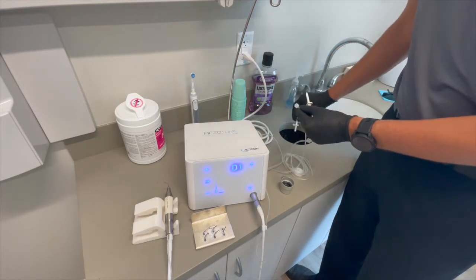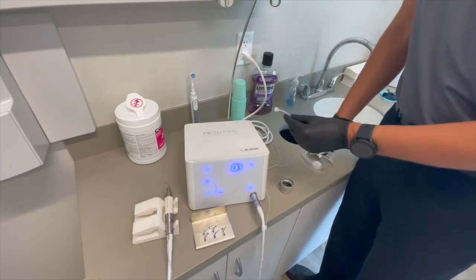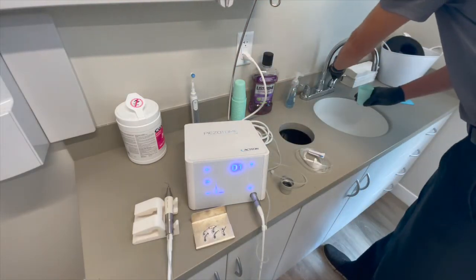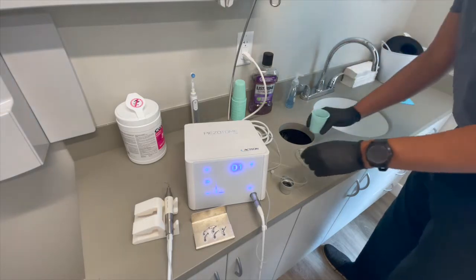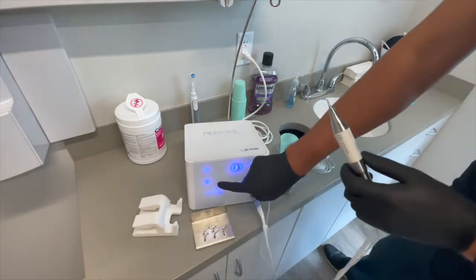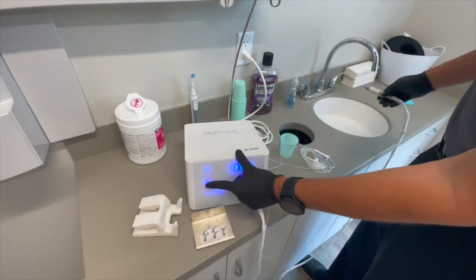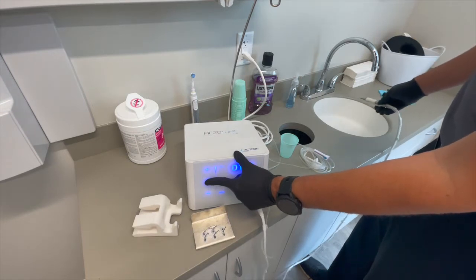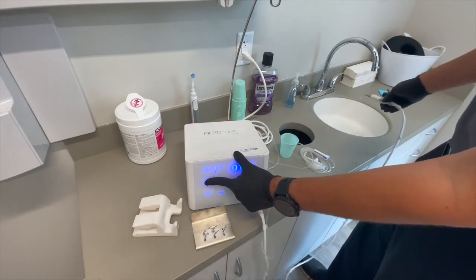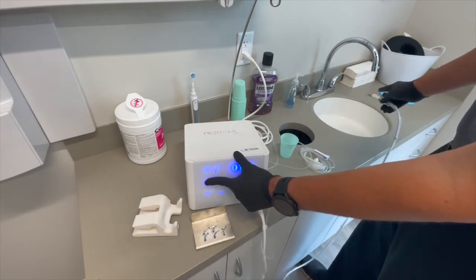If you're using the disposable version, you're going to throw that away. From here, take the end of the tubing regardless of which one you're using. Take a cup of water, fill it up with just some tap water, and stick the end of the tubing in. Take your handpiece — this button here flushes and forces water, so we're basically going to draw the water through that tube. There was no water in this line, but now it's being pulled through.